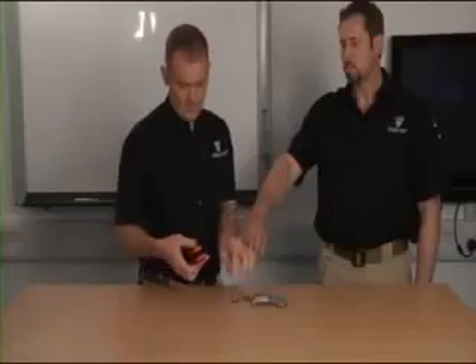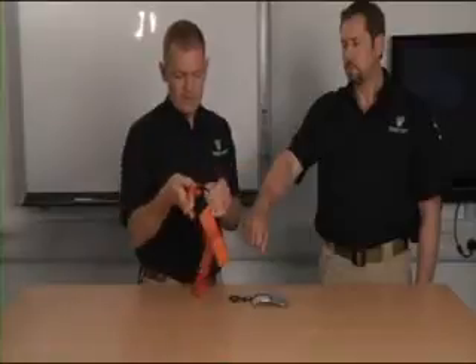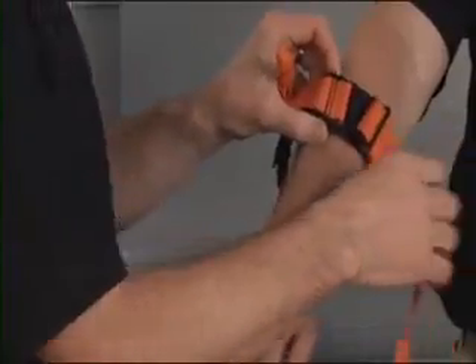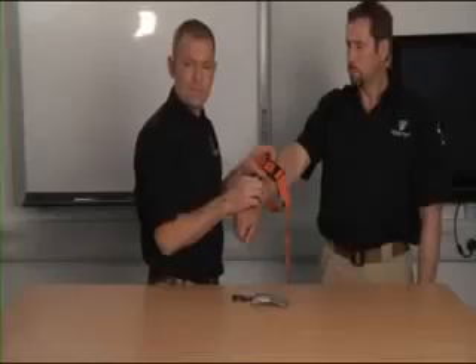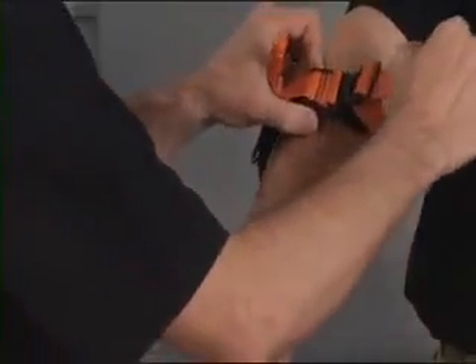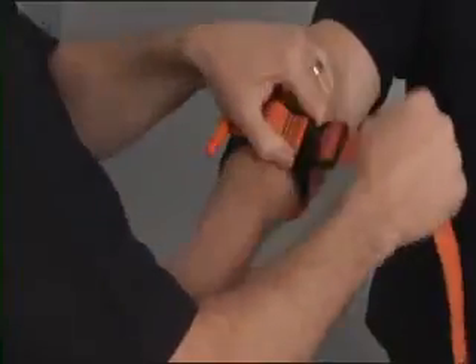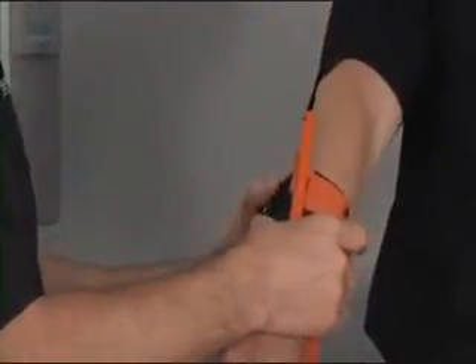The elastic bands are removed and the tourniquet is opened out and placed over the limb, aiming to get it within about five, perhaps ten centimeters of the wound edge, or in particular of the point that I think is bleeding most heavily. Having got it in place, I'm going to take up any excess material through the metal buckle so it's reasonably firm.